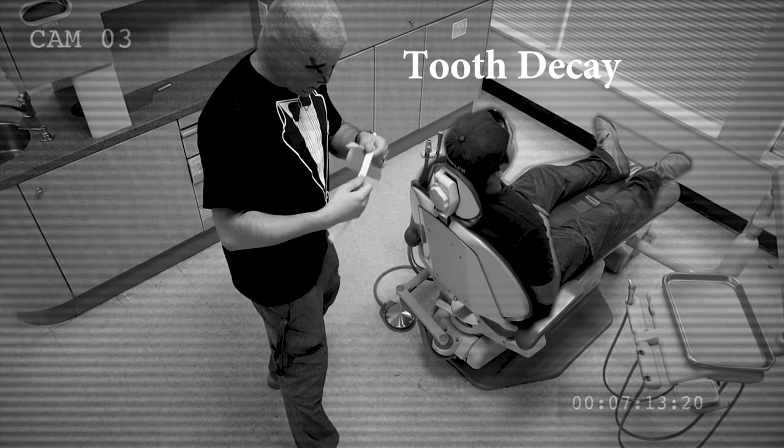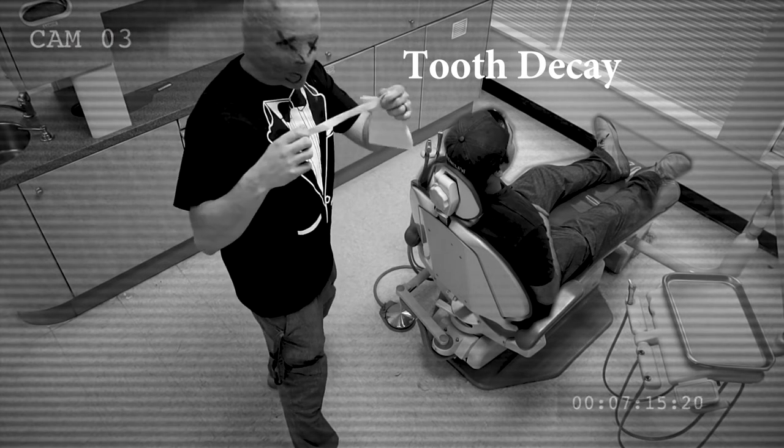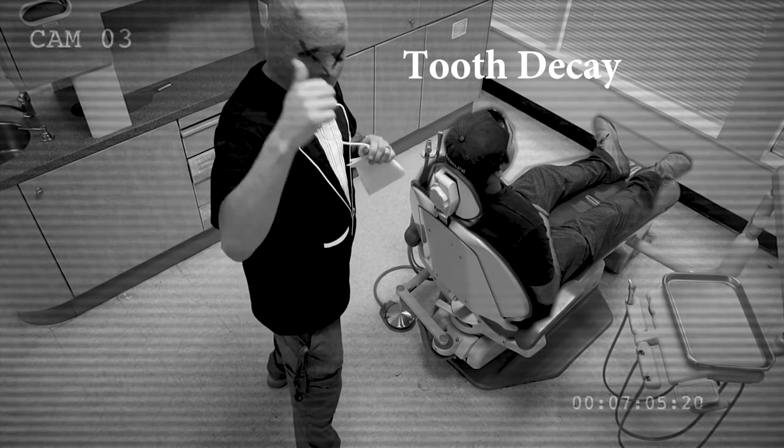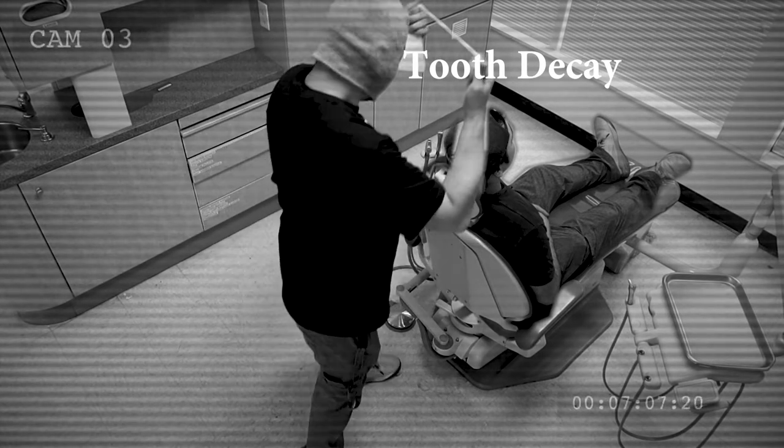Hello there — you're just putting on the patient's bib. You know you can customize that, right? Let's give it a tug. Awesome, that'll go for an adult.